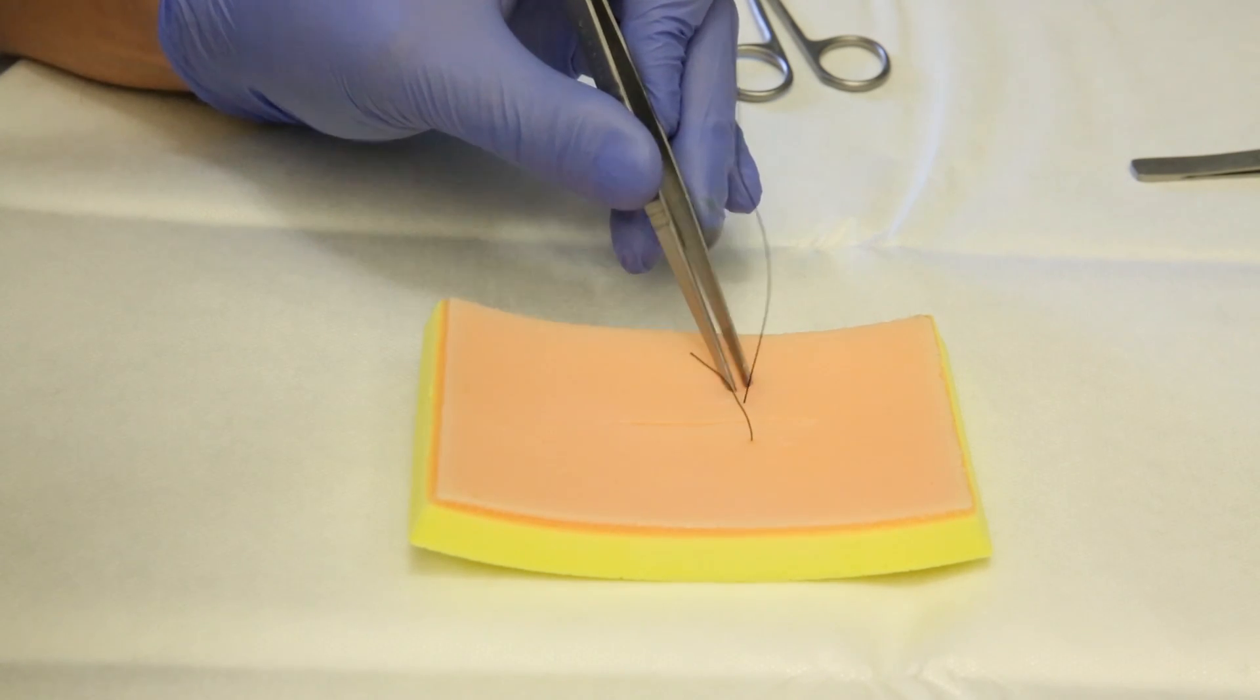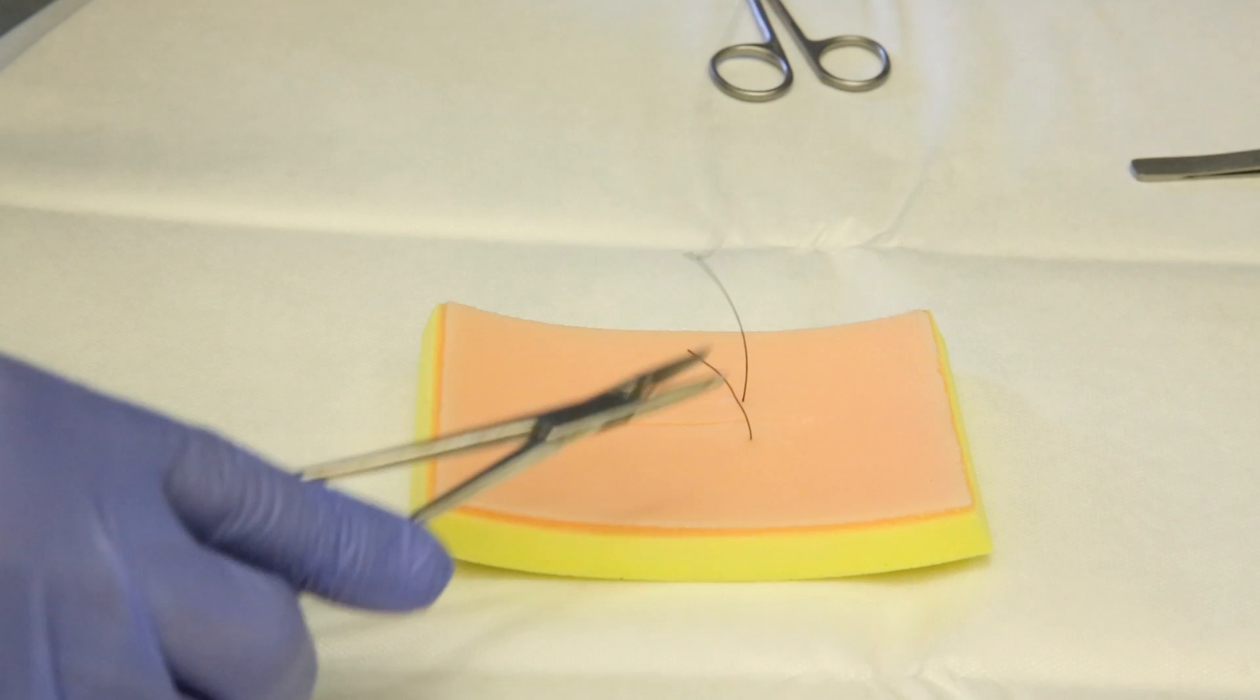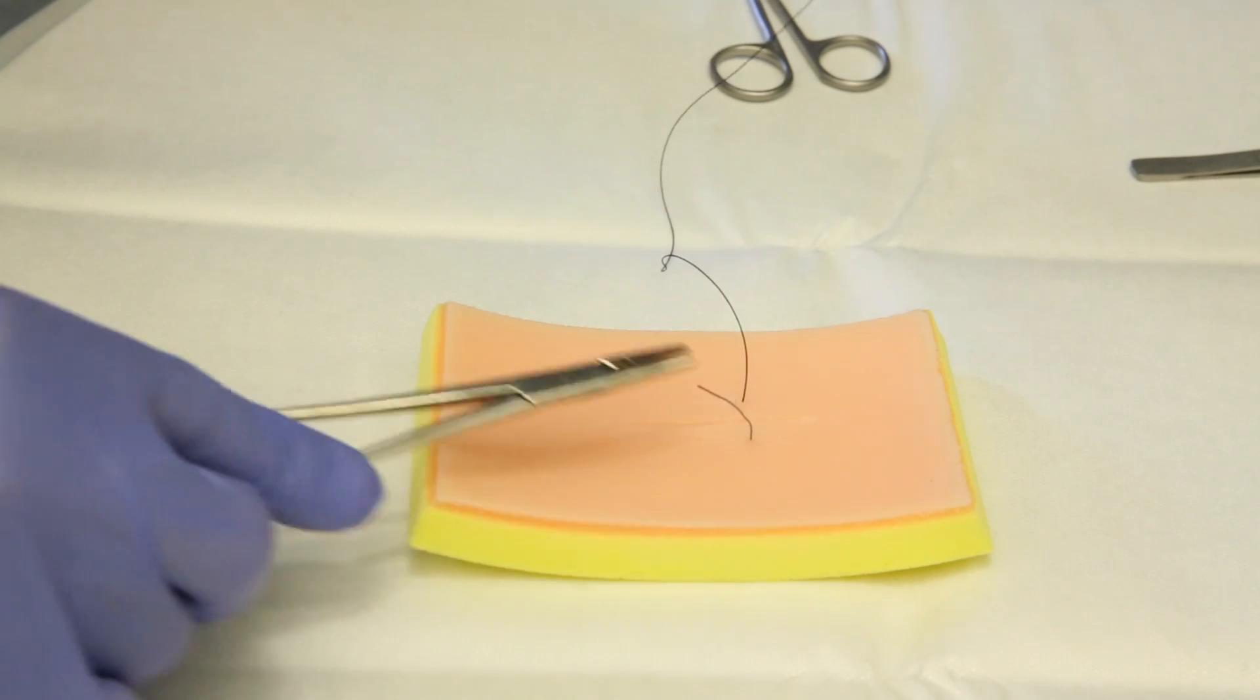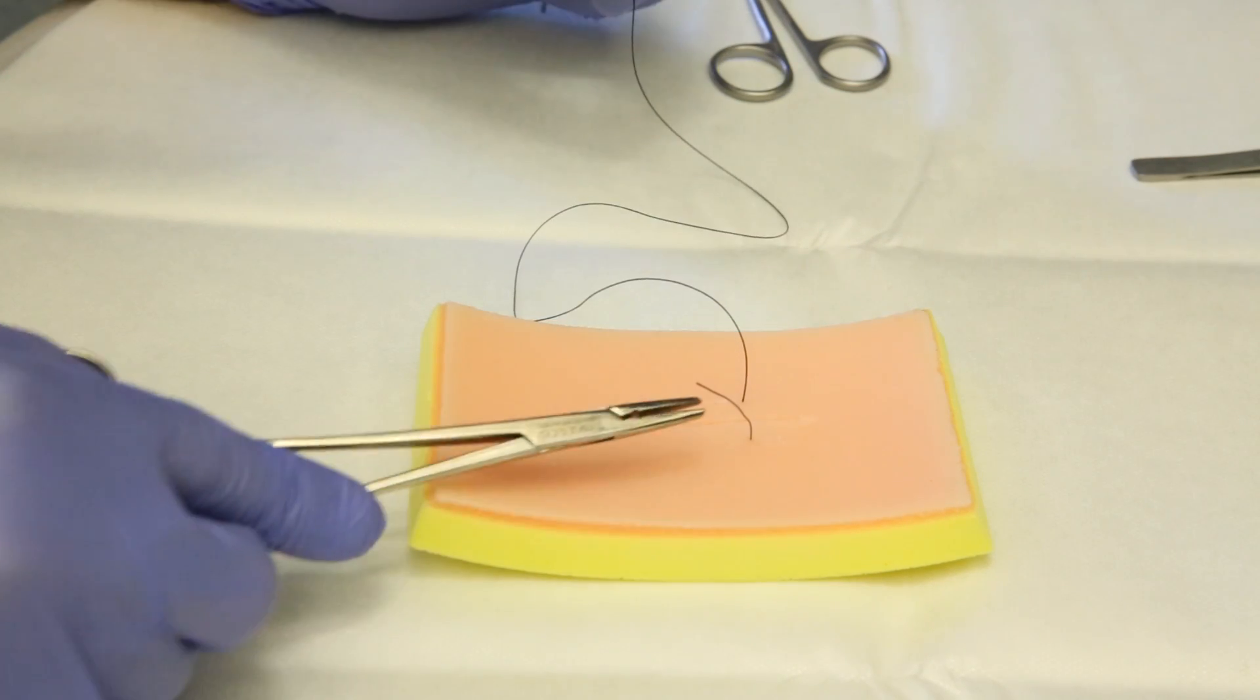So our thread now, across the wound margin, we leave about 4-5 cm from the end.